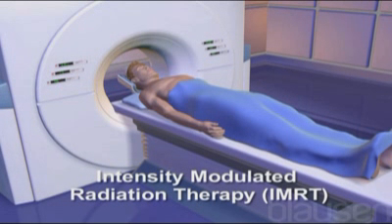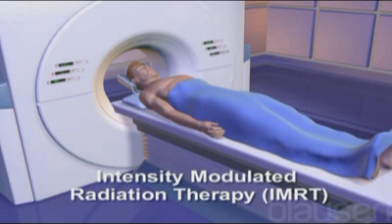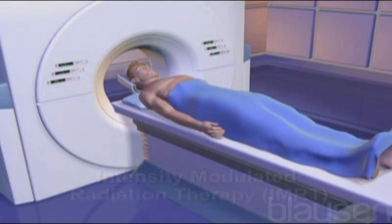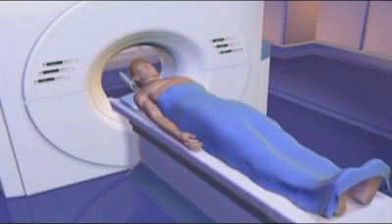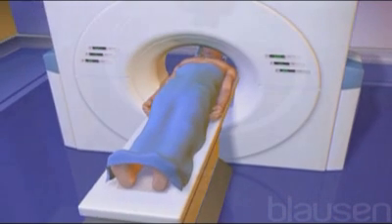Intensity Modulated Radiation Therapy or IMRT is one of the most advanced treatment methods available in external beam radiation therapy. Initially, a CT scan is performed on the affected region in order to establish the exact contours of the tumor and the surrounding healthy tissue and therefore determine the dose of radiation.